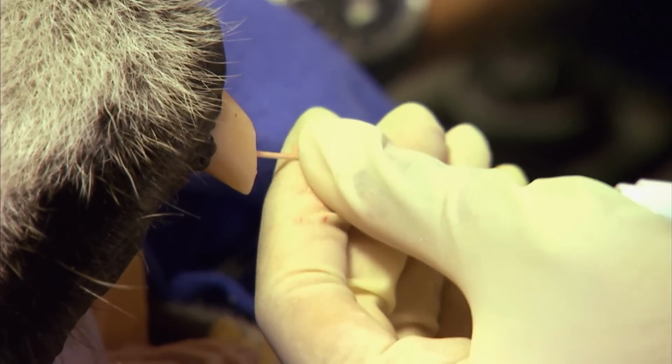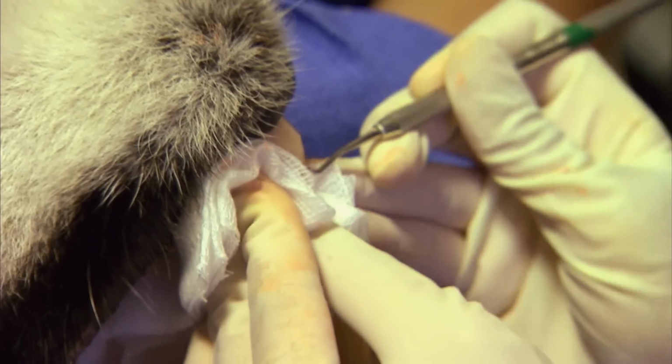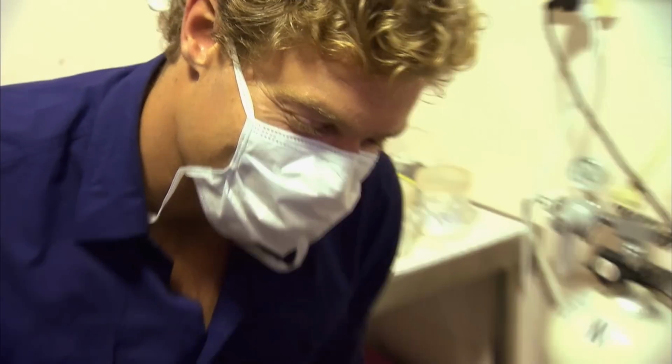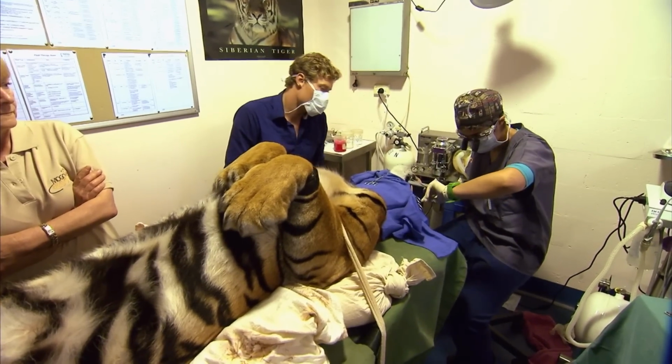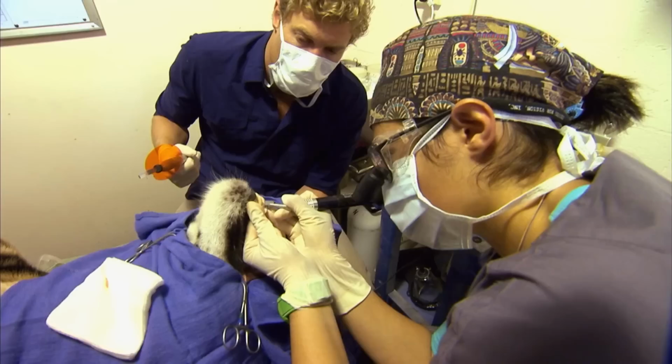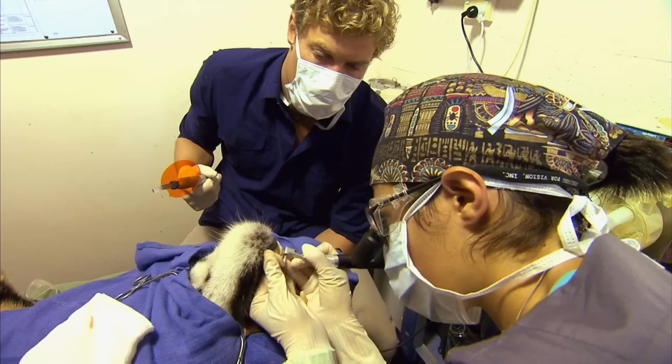What we want to do is make sure we get that right down to the bottom. The purpose of this mixture here is to push in there and just like putty to fill in that gap. And that really gives the tooth strength but also prevents any infection from occurring from here. It's actually going all right now, but you just have to remember you can't rush this sort of thing. Each step takes a certain amount of time, and rush those steps and it just won't work out. After 2 hours, Nadine is finally happy with the result. You are home and dry. My job is done. It is a relief. I feel like everything went very well.